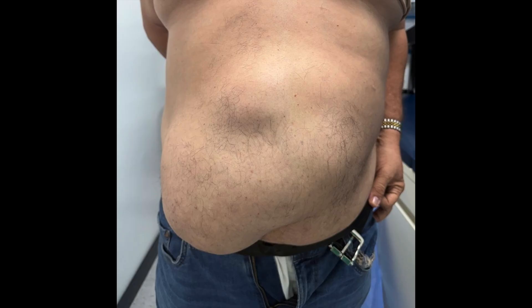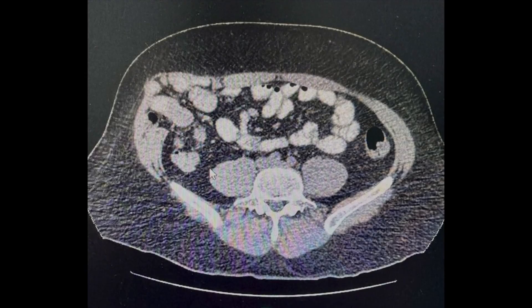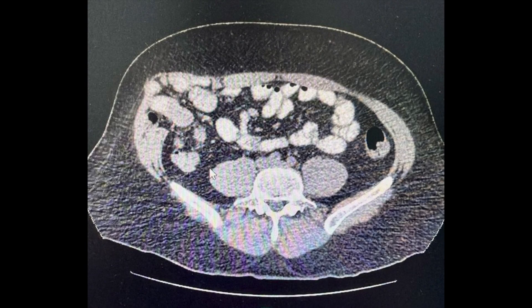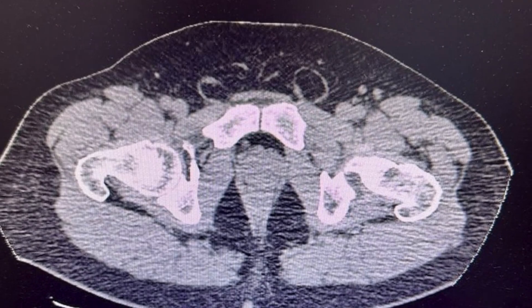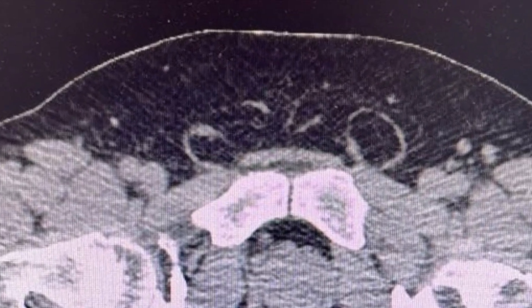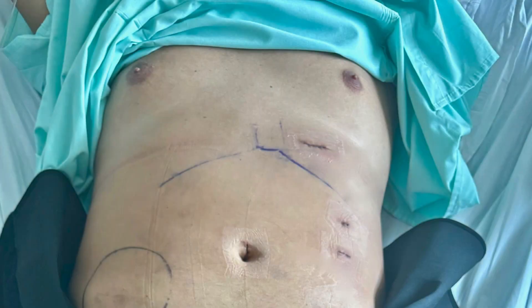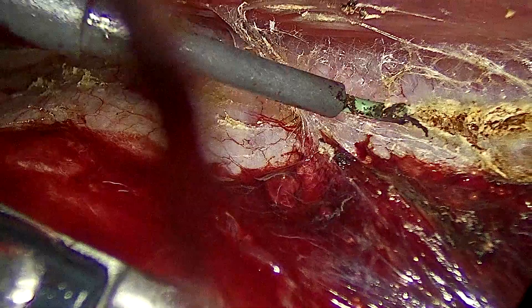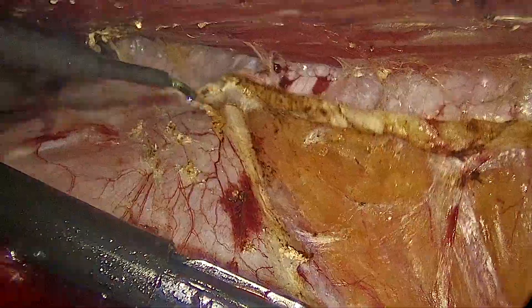This is a middle-aged male patient with a large L2-L3 incisional hernia after a complicated appendectomy. The patient also has bilateral inguinal hernias. We prefer a pre-costal ETEP approach for these cases, using initially three trocars.